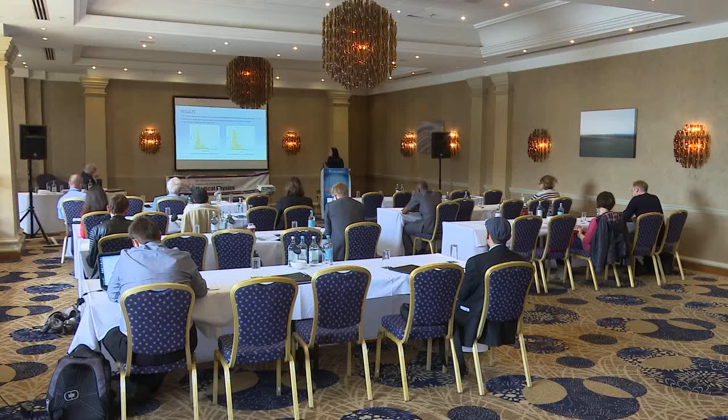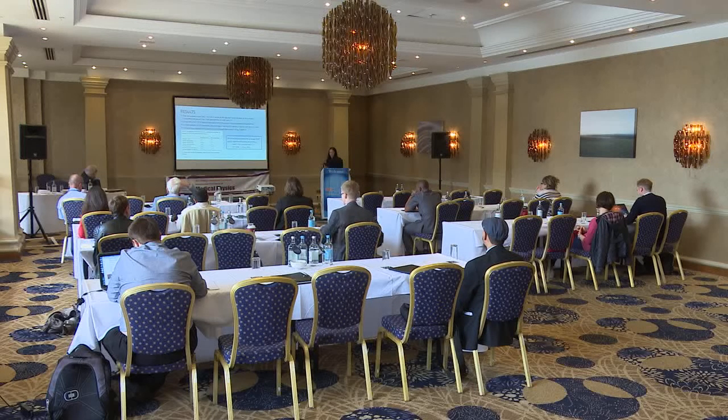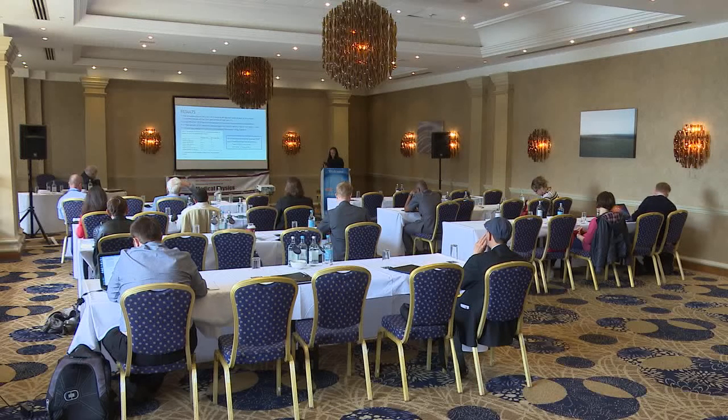The distributions of dose area product and fluoroscopy time were asymmetric, with a large positive tail, as shown in Figure 1 and Figure 2. And between the dose area product and fluoroscopy time was found a strong linear correlation in this study. DRLs were chosen as the rounded values of the 75th percentile of dose area product and fluoroscopy time distribution. Consequently, the proposed local DRLs for ERCP were 3 gray in square centimeter and 3 minutes in this study.